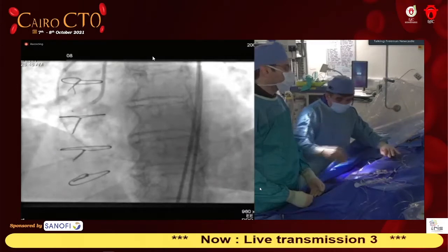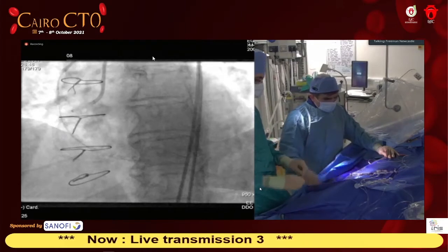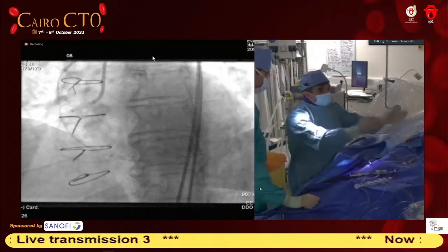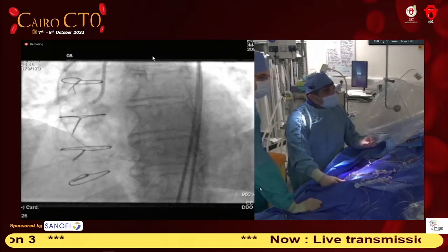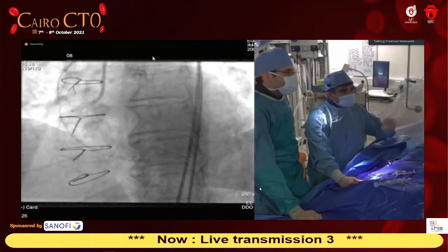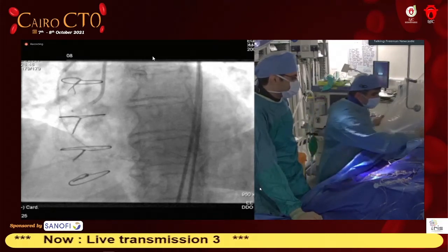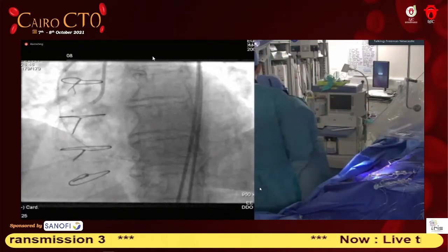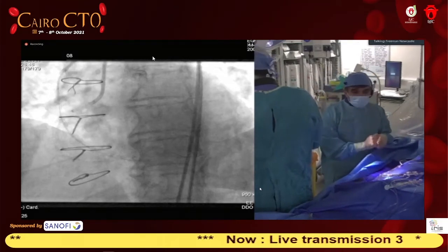You're absolutely correct. So let's take this wire out. If you're coiling an aneurysm, basically you take the coil, you put it in here, and there's a 3 ml Luer lock syringe, and you just inject hard, and the coil will just fly into the aneurysm. In here it's a little different because you have to control where you're going to put your coils. And you will notice that the flow will not stop immediately. One or 2 coils are not enough. Sometimes you have to use 2, 3 or 4 coils just to block the whole artery. This is where some people think the vascular plug is a little bit better. But is there a risk of coil migration, for example? Yeah, exactly. This is why you have to be very careful where you deploy it.